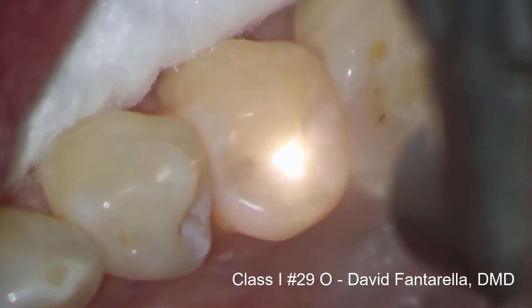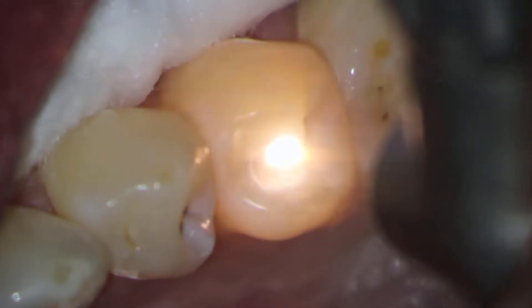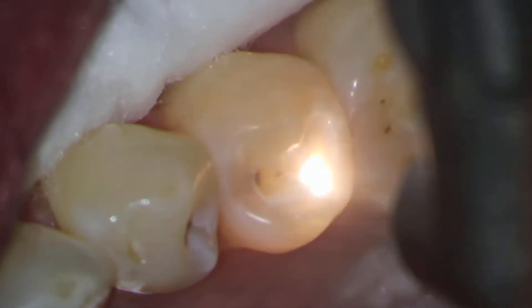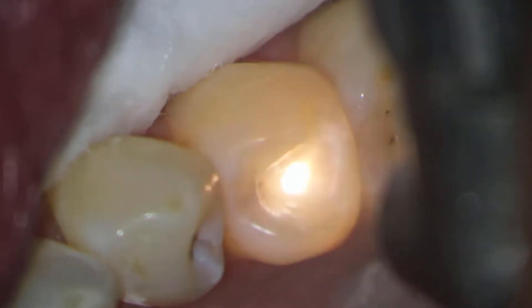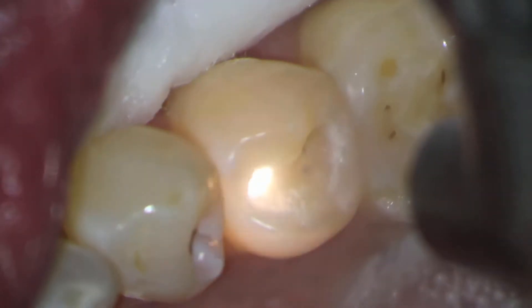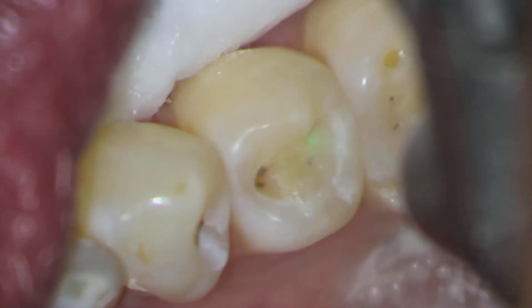This Class 1 on tooth number 29 was completed with Solea from start to finish. The laser was used to vaporize tooth structure, perform the cavity prep, excavate the decay, and finish the prep. The patient was not anesthetized and total chair time was only 10 minutes. This case demonstrates how Solea makes the restorative process faster and easier while delivering an amazing patient experience.